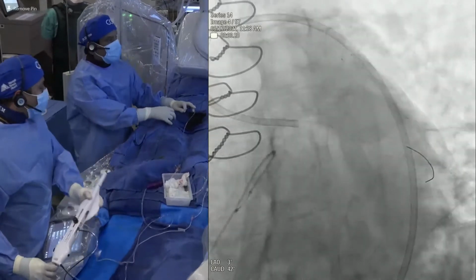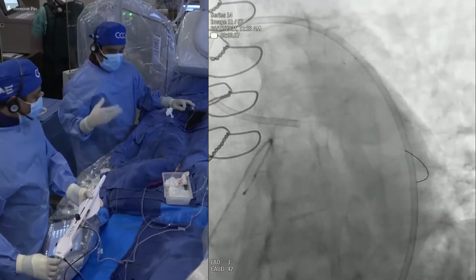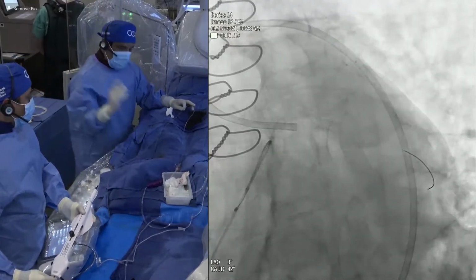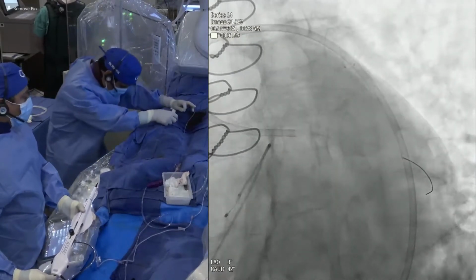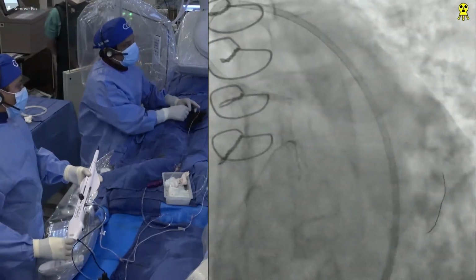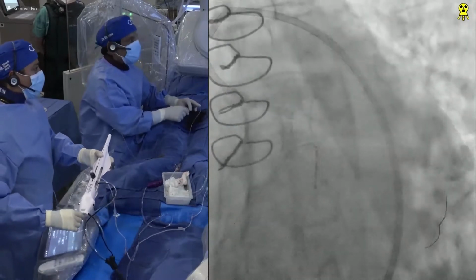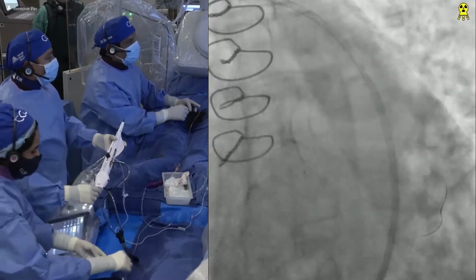Now the question is, why not laser? This patient was referred basically for rotablation, and we have had success. With the contrast, laser would be the second choice in this particular case, or maybe for some people could be the first choice. So we had done a 2.0 burr. Now we are going with a 2.15 with my associate Parashram here, and we have 2 fellows, Twinkle and Jonathan, and of course the rest of my cath lab staff, all ready for the 2.15.